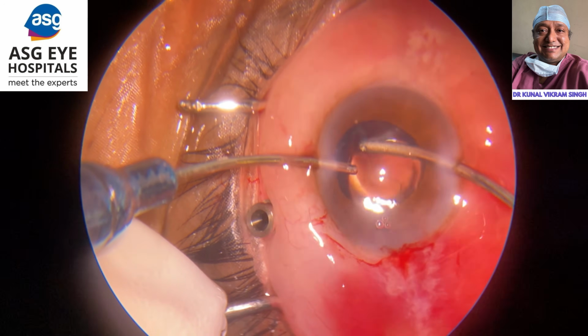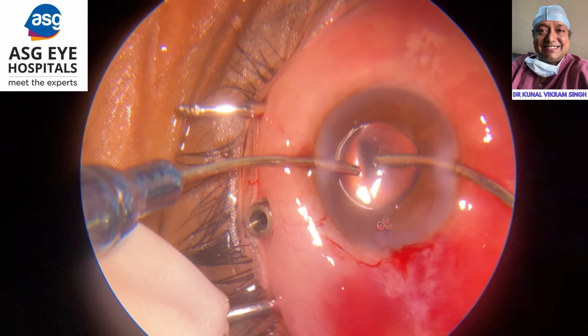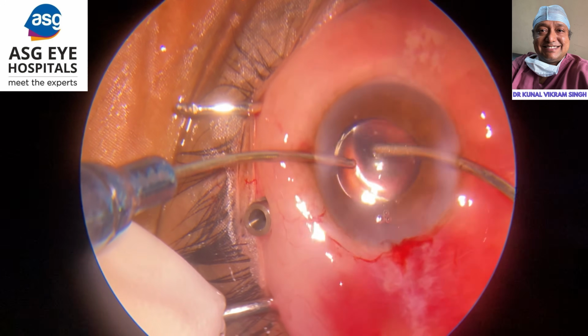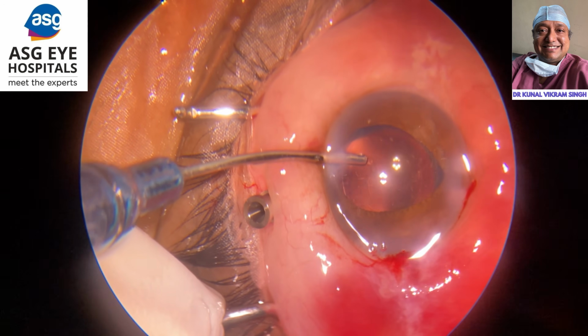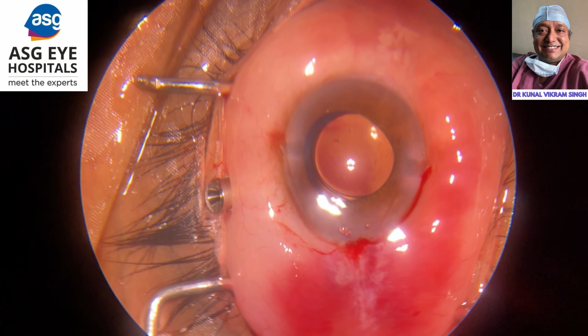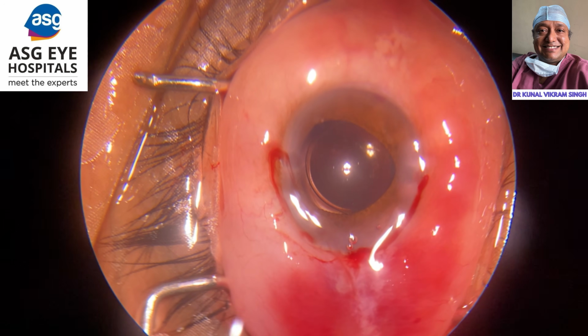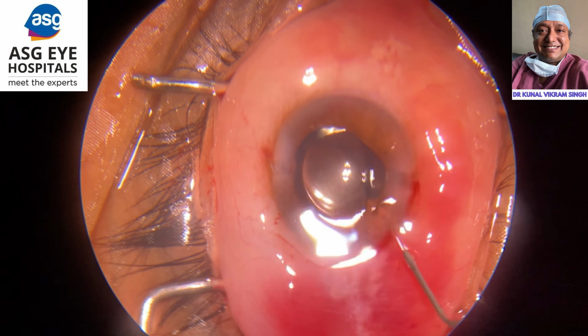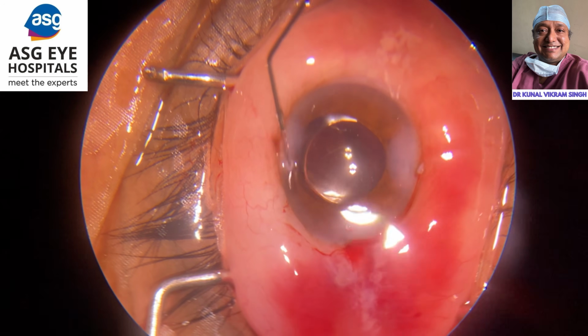Simply the anterior vitrectomy was done, and the IOL was slid inside the bag, and things were concluded after this. So now we see that the outcome in this particular case was positive. There was not much damage. The patient was okay. Things were pretty much in control. So the side ports were hydrated, and the case was concluded after that.